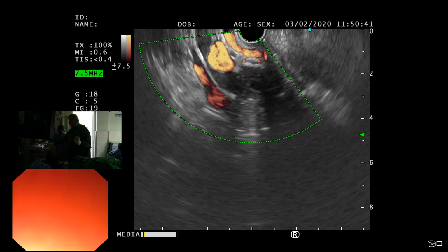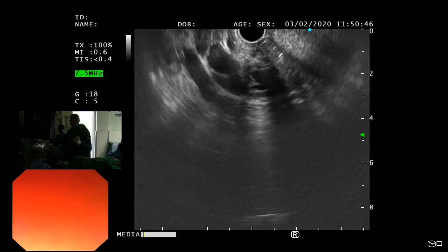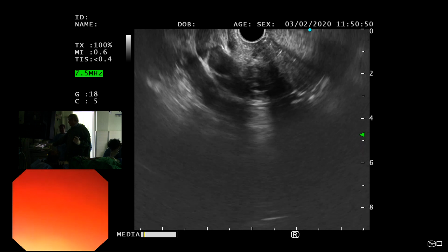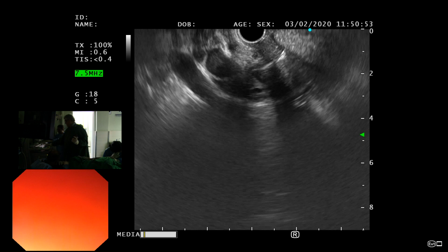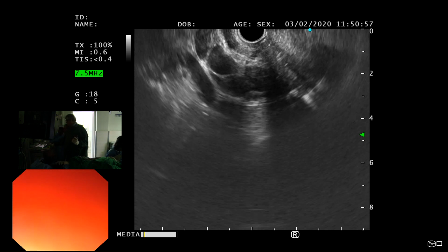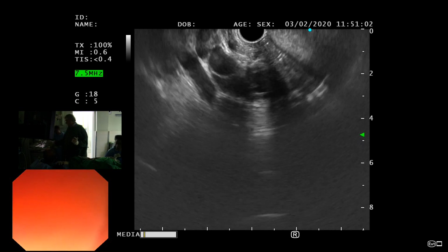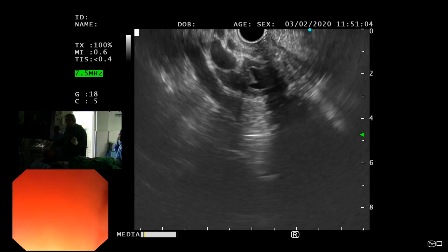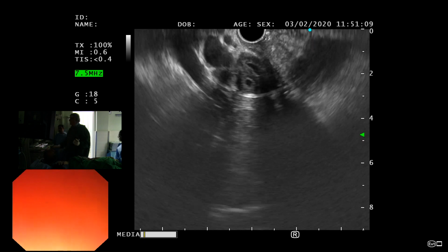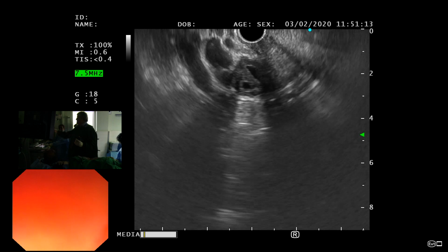कर्सर किधर है? हटाओ डॉक्टर. कर्सर प्लीज. No, I don't know why it is not here. नहीं वो तो गैस्ट्रोडुओडेनल है. नहीं, वो तो खैर आना चाहिए. You can't see the cursor, but Khalid, can you see that duct here? There are two ductal systems here.